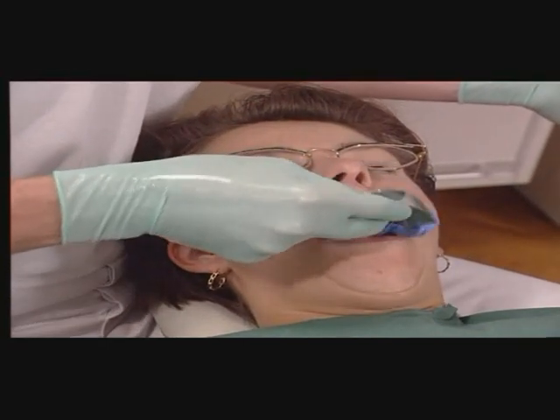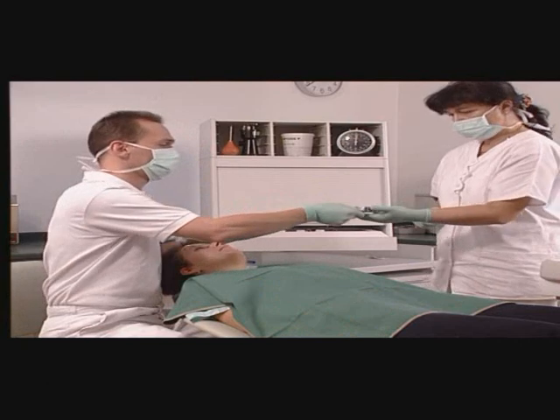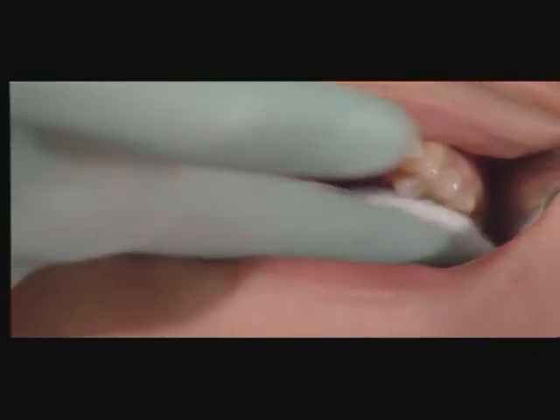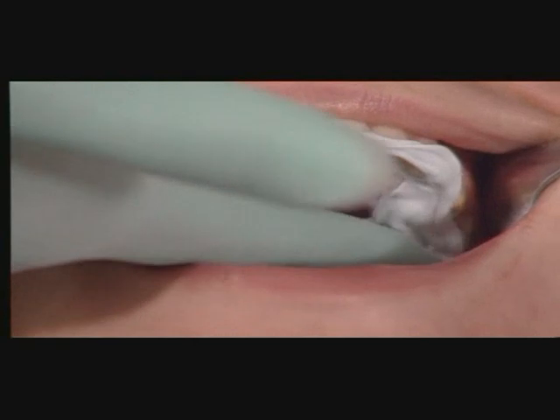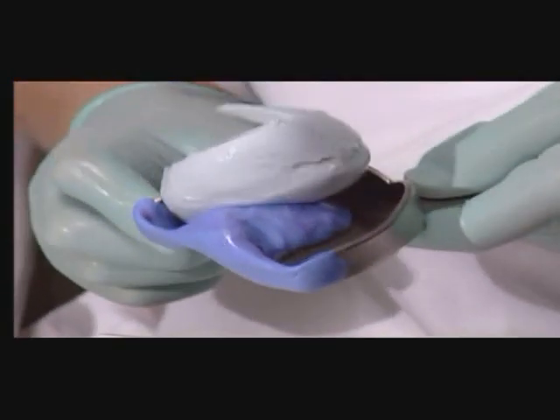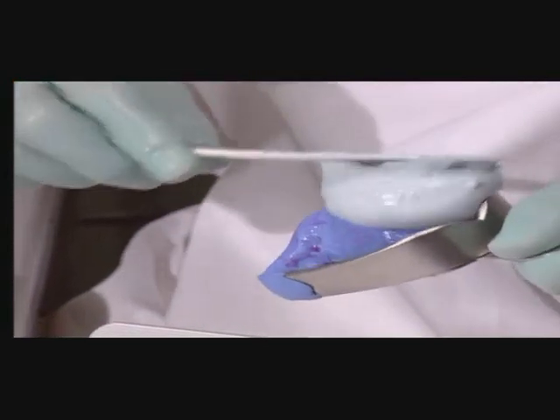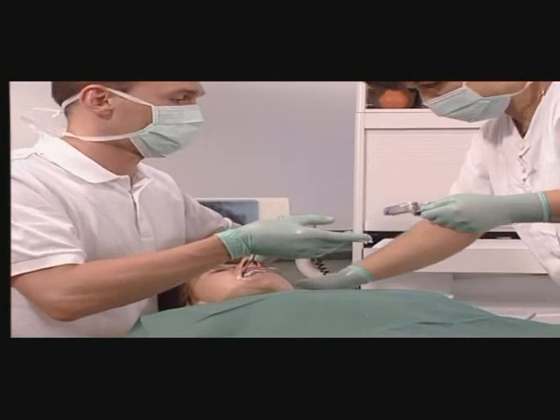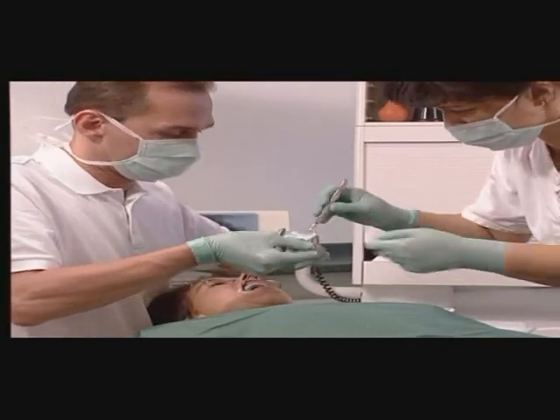The teeth are greased with alginate beforehand to make it possible to take bubble-free impressions of the teeth rows. That prevents an air cushion in the fissure region that could cause bubble formation. The tray is also filled with a bubble-free homogeneous alginate impression compound. But the fingers must not be moistened with water in this process because that would cause the powder-water mixture to be changed.